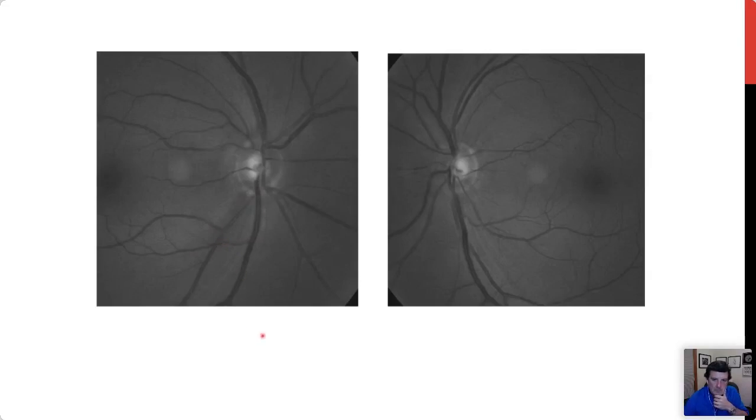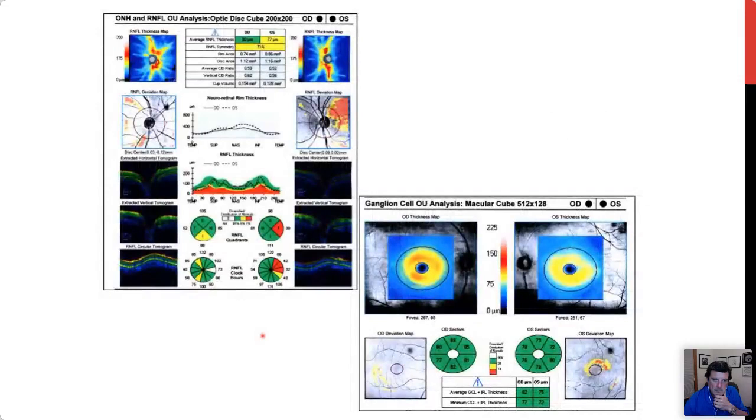If you step back one, please, Greg. When we look at the quadrant and the thickness maps, which are red in the left eye, the quadrant and the clock hours, understand that when this anatomy is measured, that's a lot of territory that's being averaged together. And when that happens, you can actually have things that are abnormal that can come up as normal. And that's really what happened mostly in the right eye. It's borderline statistical significance, but there's a lot of territory being averaged in there. So we can advance, Greg.